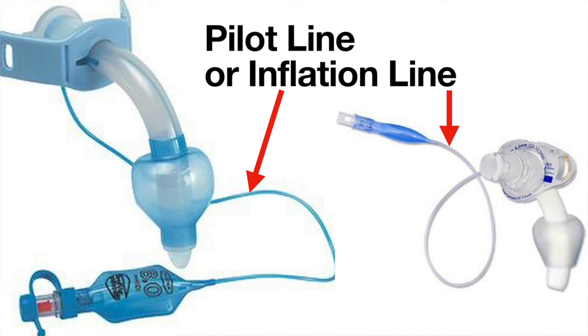There is a line which hangs off the exterior of the tracheostomy tube. This is called a pilot line or inflation line. This line enables the cuff on the tracheostomy tube to be inflated.